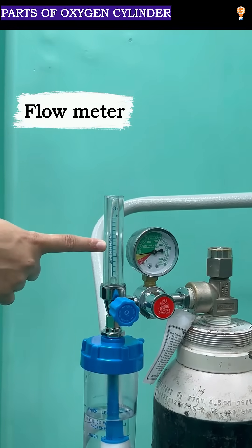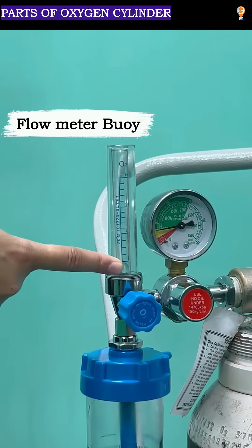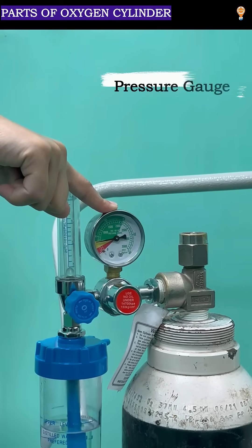This is the flow meter. The ball which you are seeing is the flow meter bar. The next one that you are seeing is the pressure gauge.